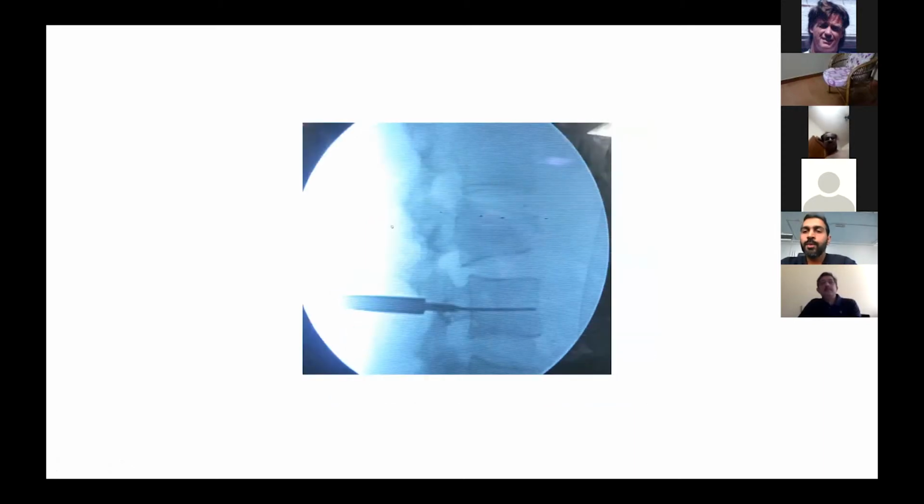Afterwards, we are going to replace the trocar. We are going to place a guide wire and then place a tube over it. Then we are going to tap over the guide wire. We have to tap up to the mid half of the body. We are not going to go beyond this, because afterwards our wire will become loose and it may be retracted with this tap, and placing a wire will be difficult the next time.